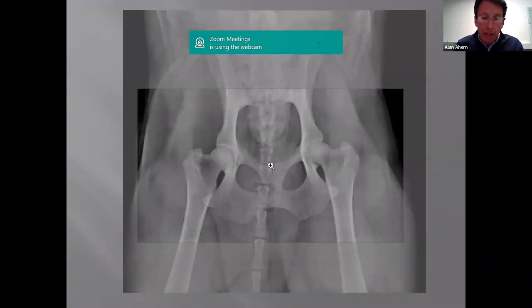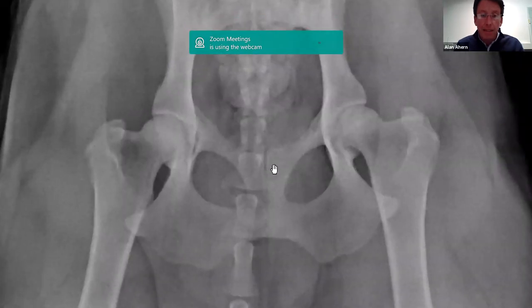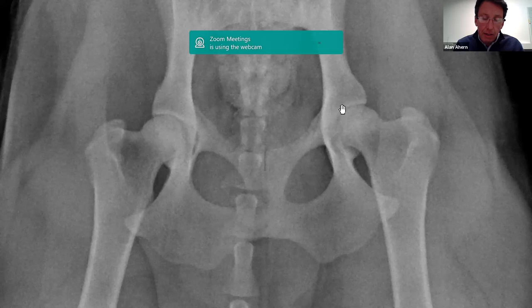Again, if we highlight the hips, we can see that we have lovely curves here and the balls are really well seated into the sockets. Can you see that here? This dog had an overall score of 1. It's a Bernese. That's a good example of what's really ideal and what's maybe less than ideal, I don't know.